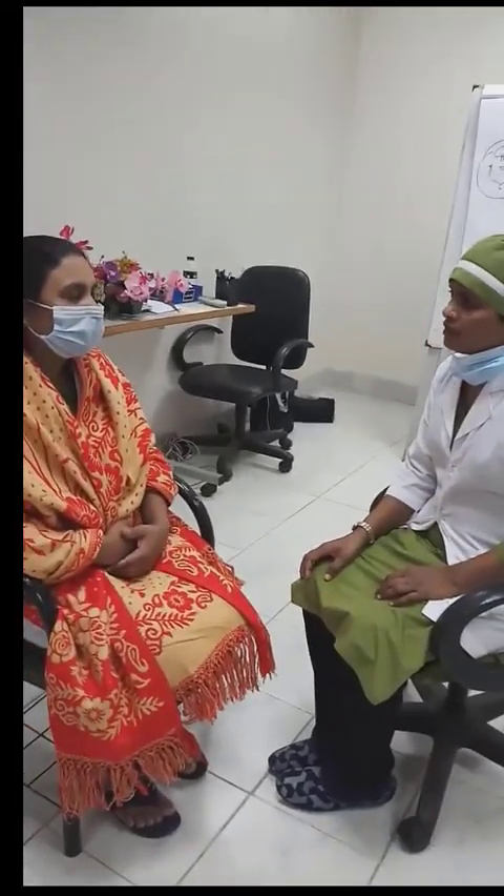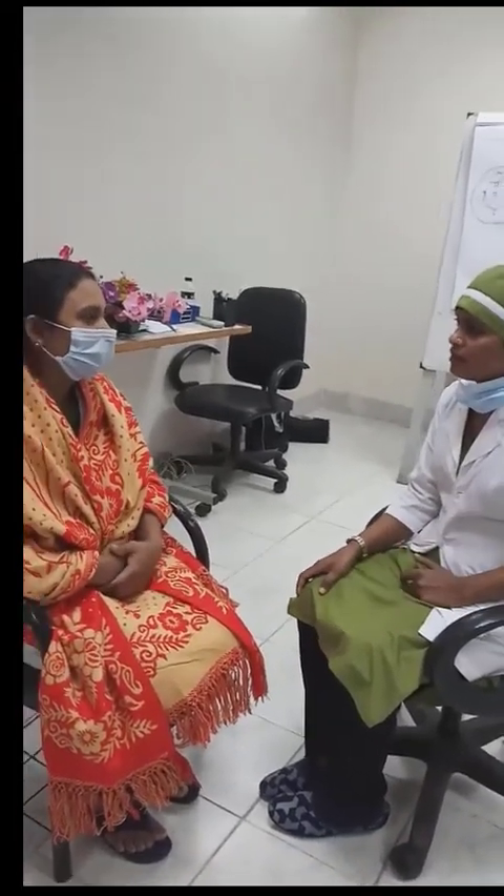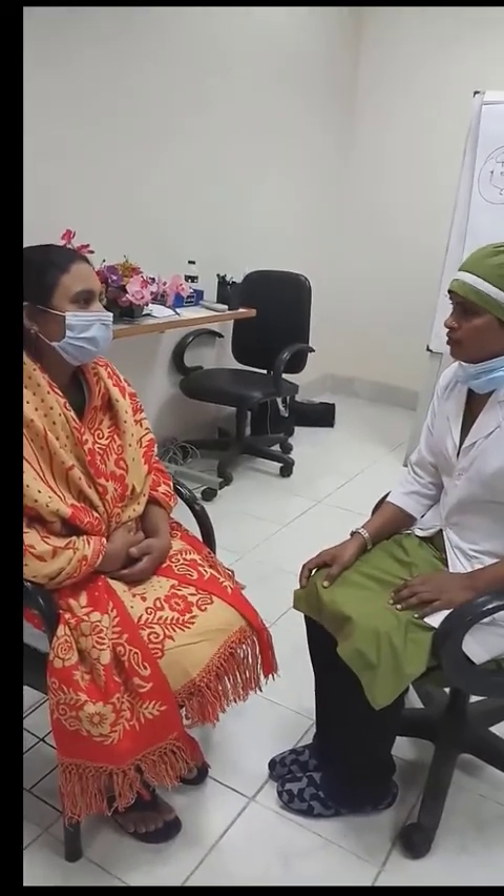This video shows how to perform visual inspection of the cervix by acetic acid.